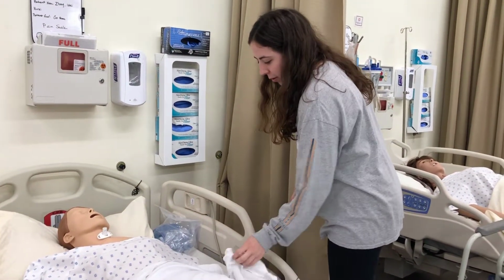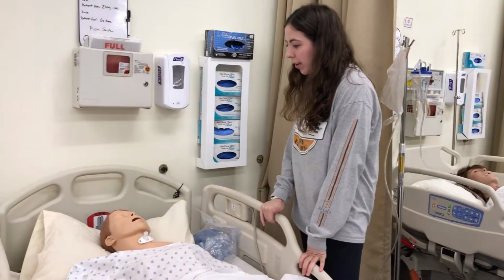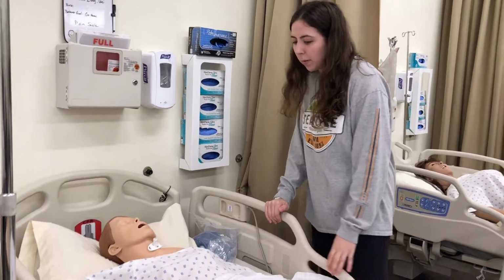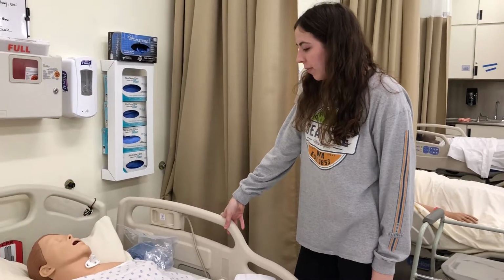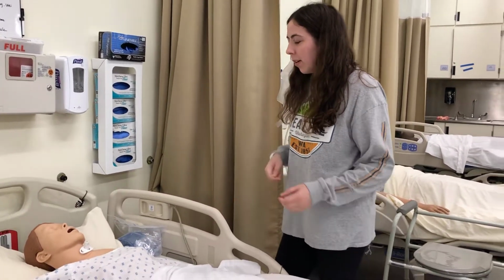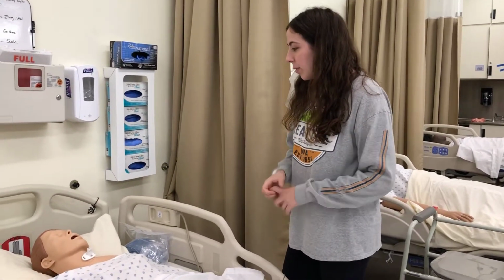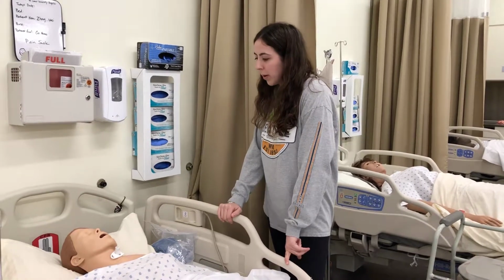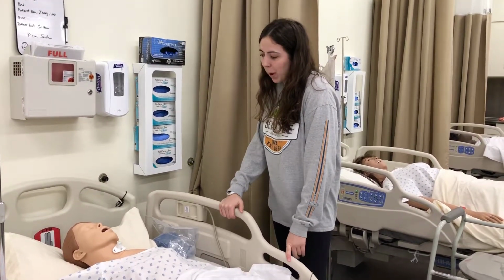So today I'm just going to be collecting some urine from you and straining it because I've heard from the doctor that he thinks you have kidney stones. We're just going to see if you do, and if you do, then I'll take your urine sample and strain it, and we can send it off to a lab, and the doctor can determine what the best treatment for you is, and how we can prevent this from happening in the future.